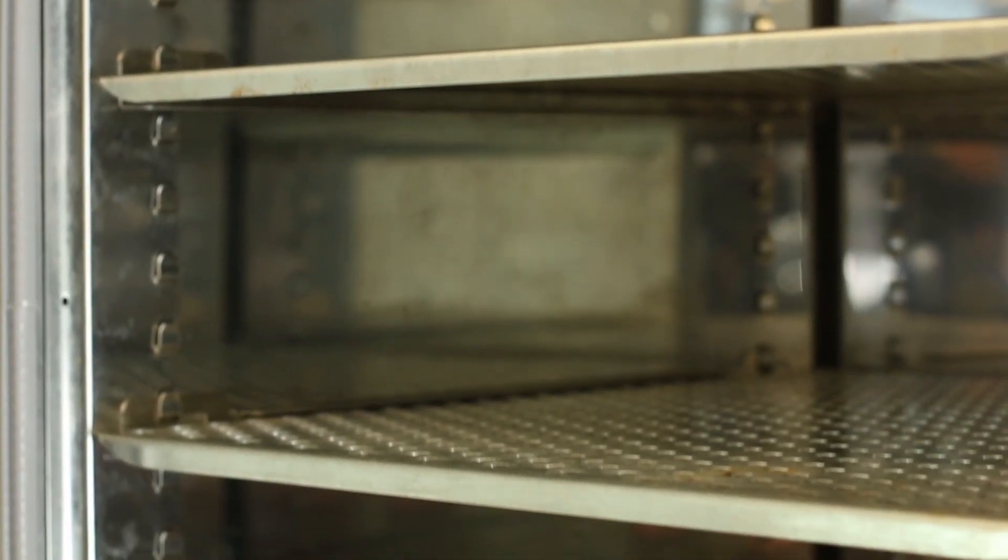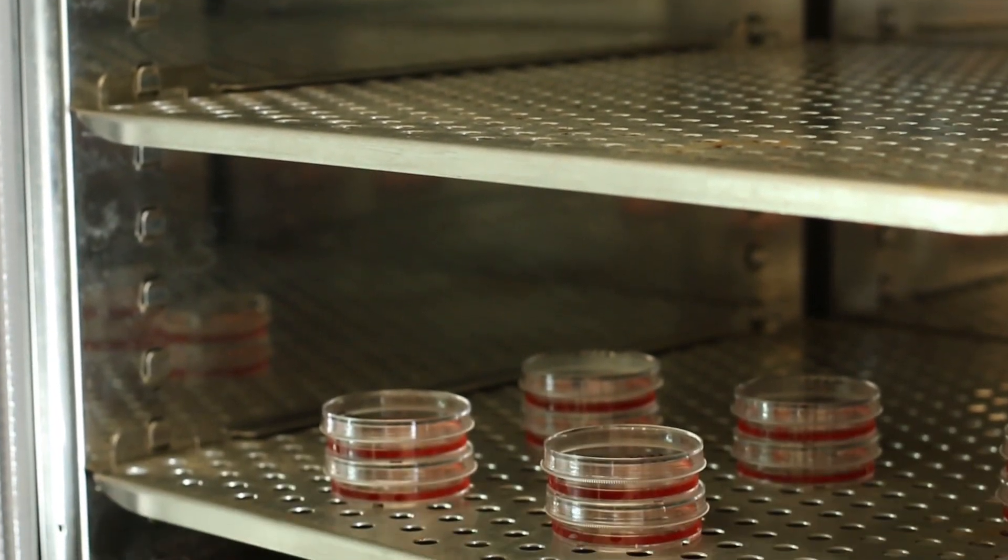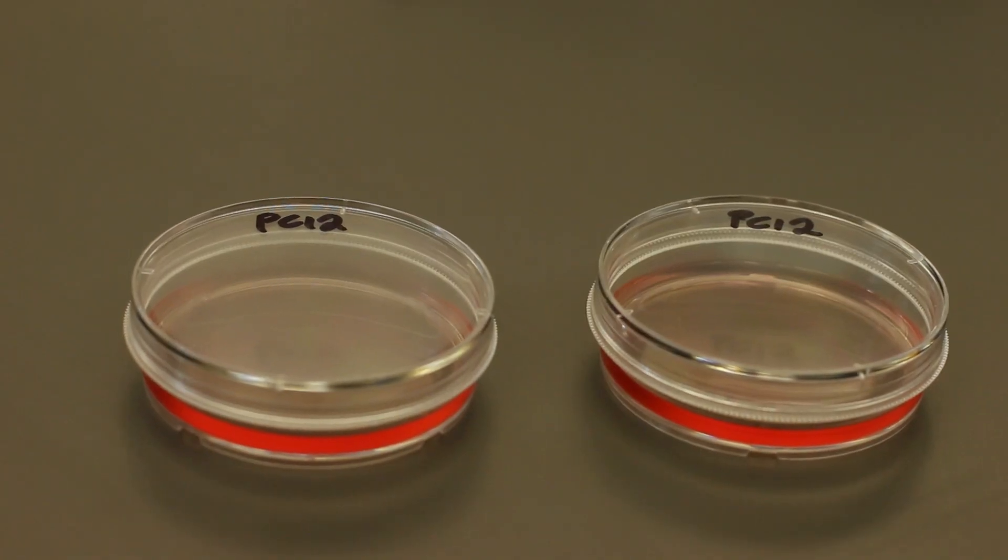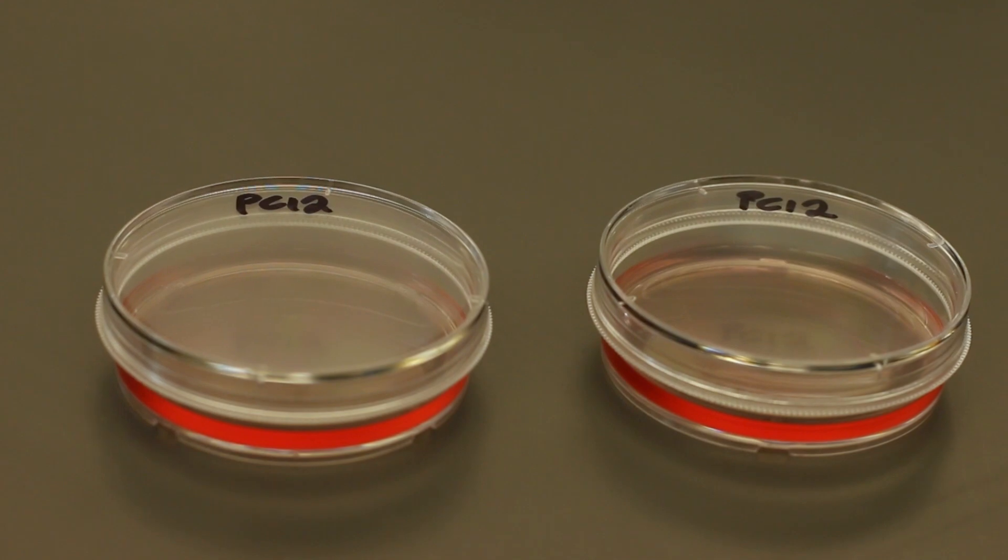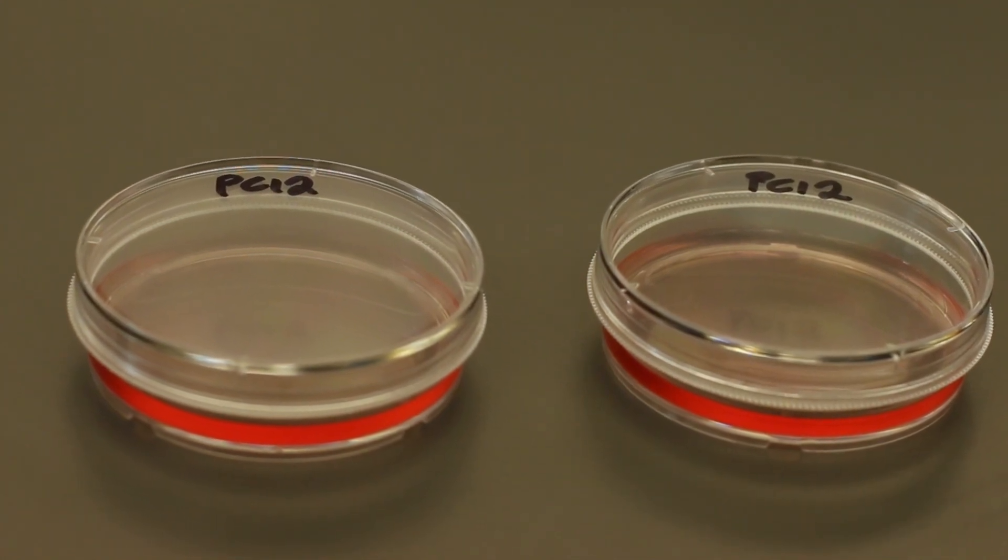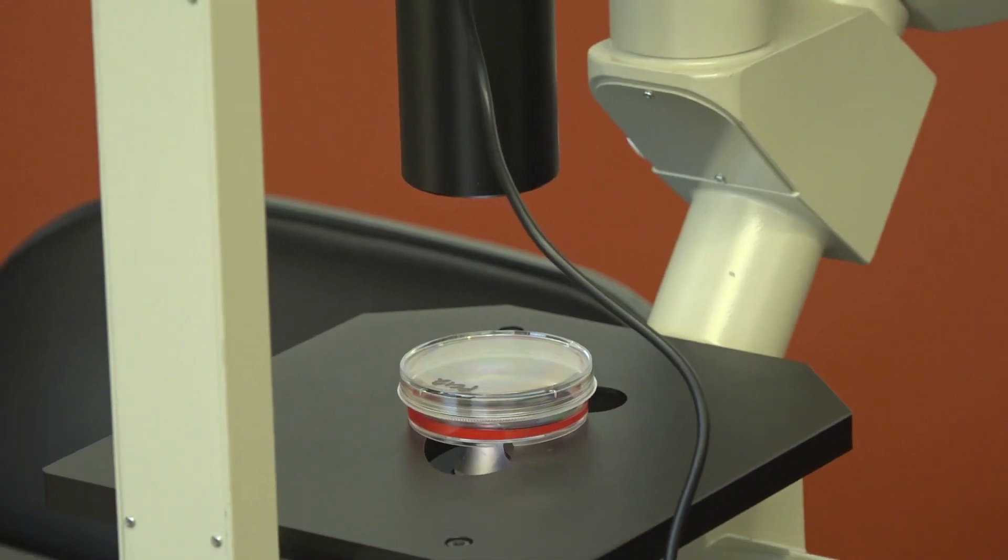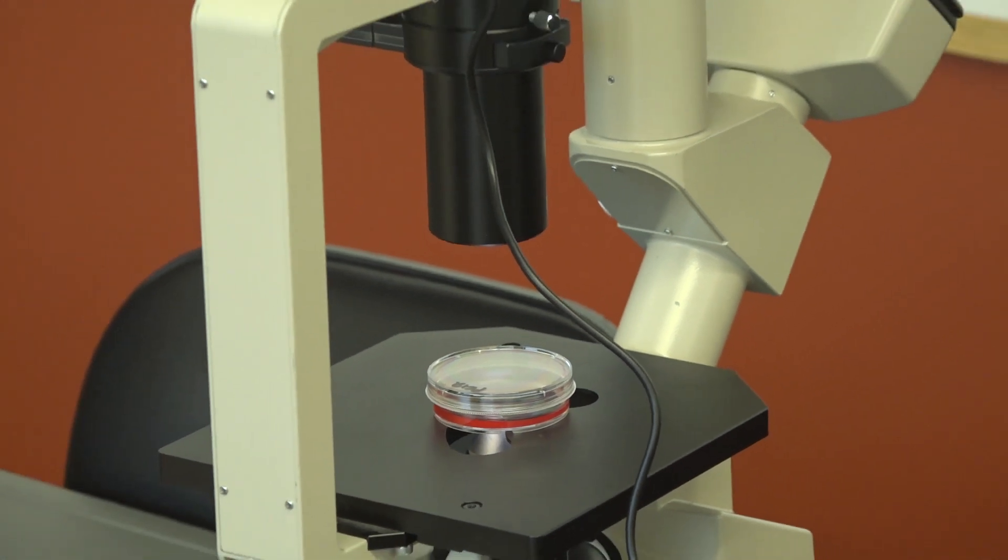So now let's open the incubator and take out our PC12 cells. The pink liquid inside the cell culture is the growth medium which provides the nutrients such as glucose and amino acids to the cells. Now let's take a look at these cells under the microscope.